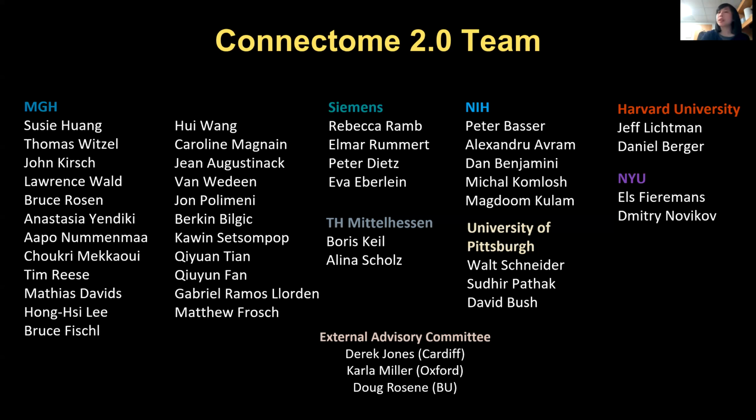This was actually done earlier as part of another high performance gradient project under the BRAIN initiative, led by David Feinberg at Berkeley with the impulse gradient. That is a high performance gradient with Gmax of 200 millitesla per meter and slew rate up to 900 Tesla per meter per second for 7 Tesla imaging. They piloted that peripheral nerve modeling into the development of that coil, and it has proven to be quite successful.